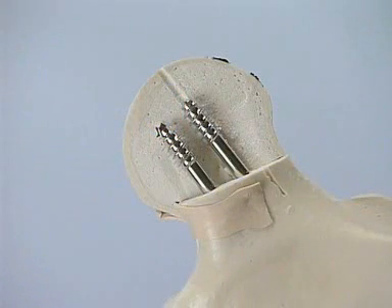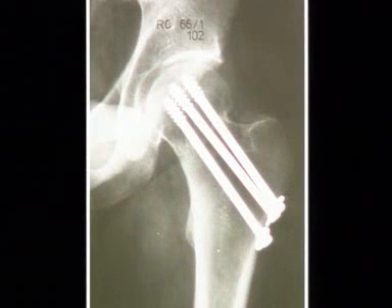Inspection of the screw position in the femoral head. In fact, the screws could be even a little longer. Here is our clinical example in a two-year follow-up x-ray.